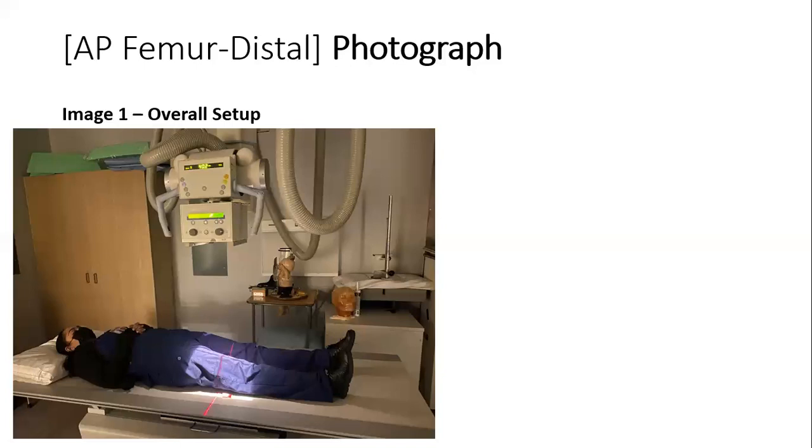The image receptor location will be our table bucky. Our SID for this image should be approximately 40 inches from the table bucky.